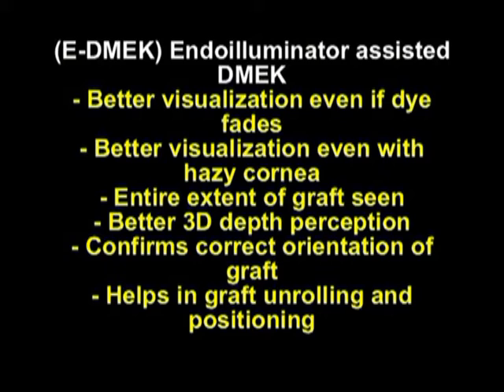The entire extent of the graft can be seen at the same time, as opposed to the slit lamp where only part of the graft can be seen. You get better three-dimensional depth perception because of the oblique angle of the light. It helps in easily confirming the correct orientation of the graft and also helps in illuminating the entire graft during graft unrolling and positioning.